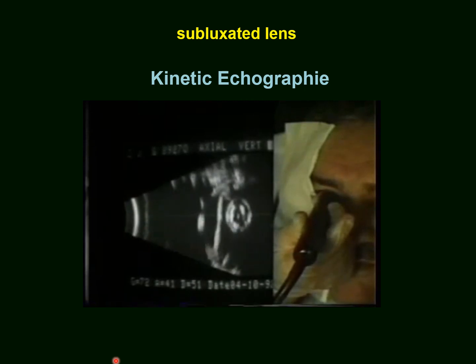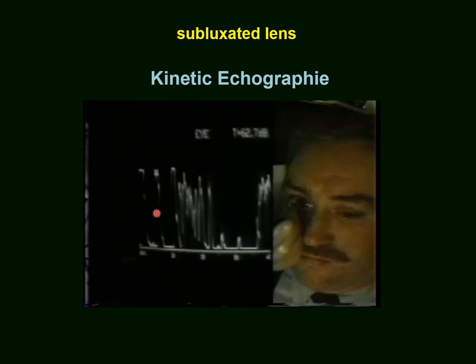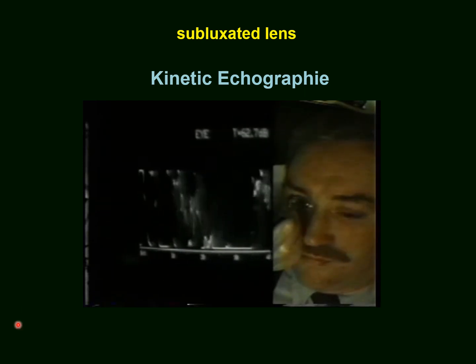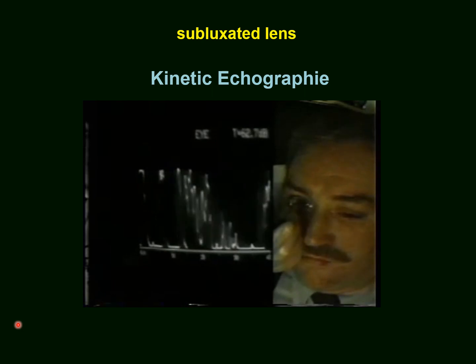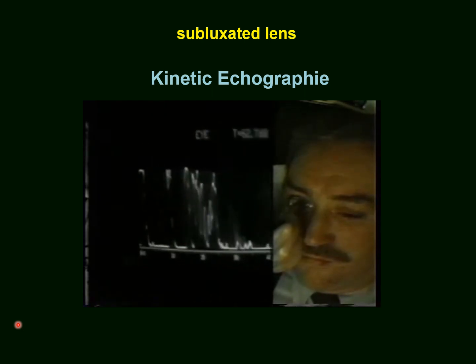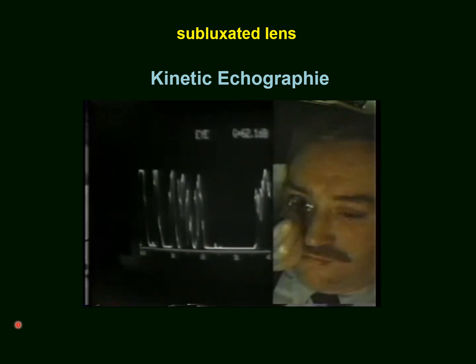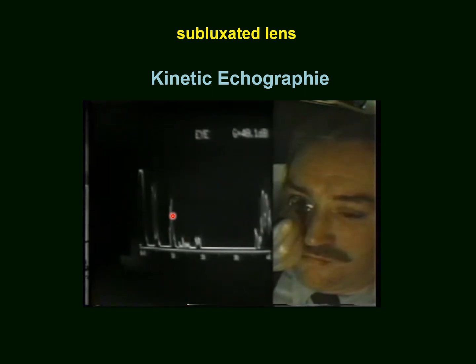And here again, the A-scan, watch the iris, the peak of the iris, that shows this brief trembling after movements when the probe is not moved. Here you can see it, especially at reduced system sensitivity.